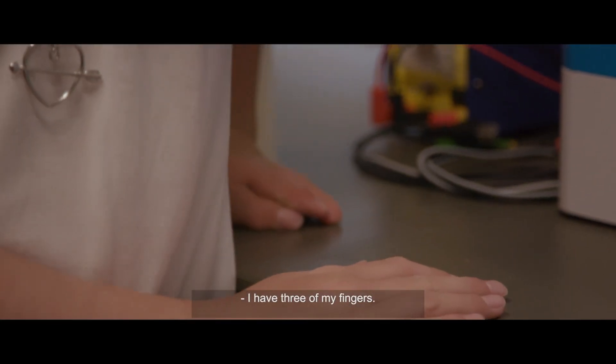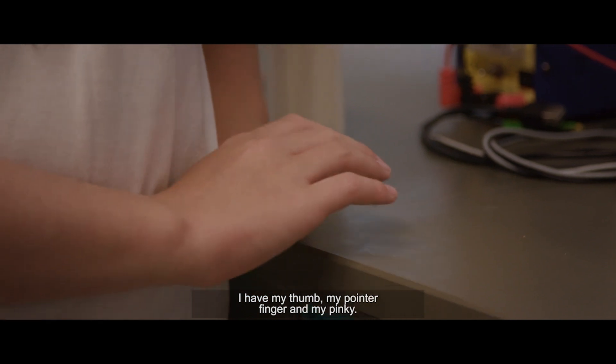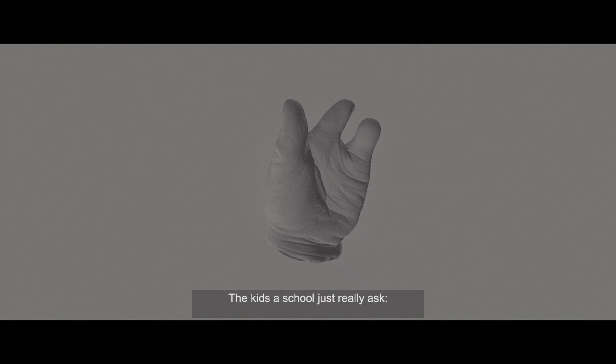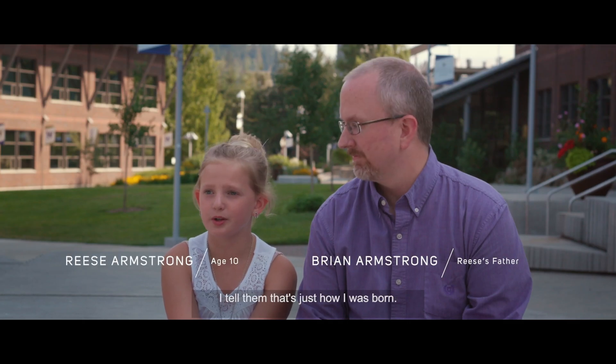I have three of my fingers. I have my thumb, my pointy finger, and my pinky. The kids at school just really ask, well, what happened? I tell them that's just how I was born.